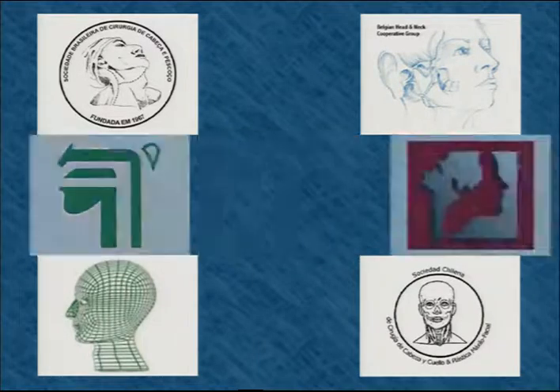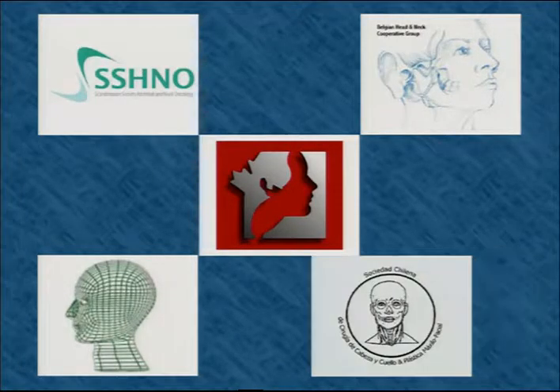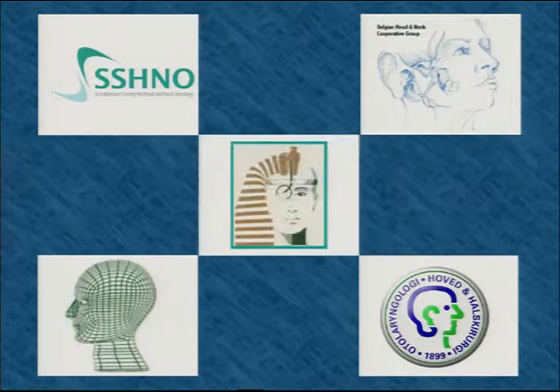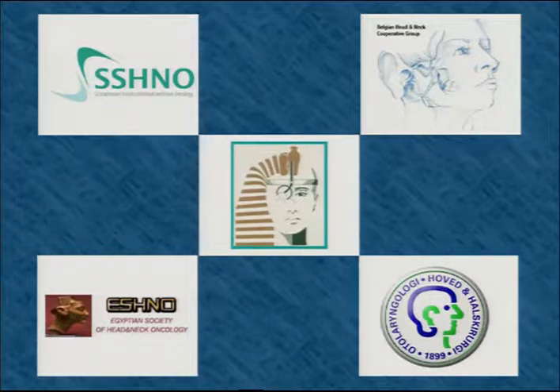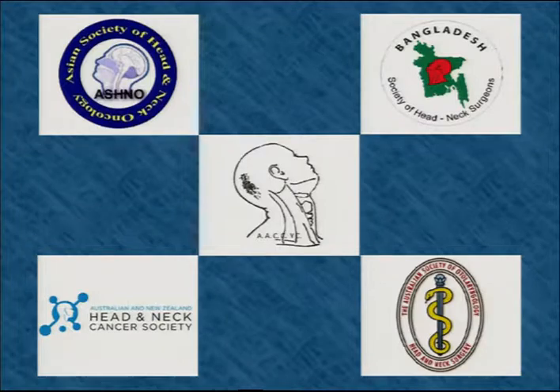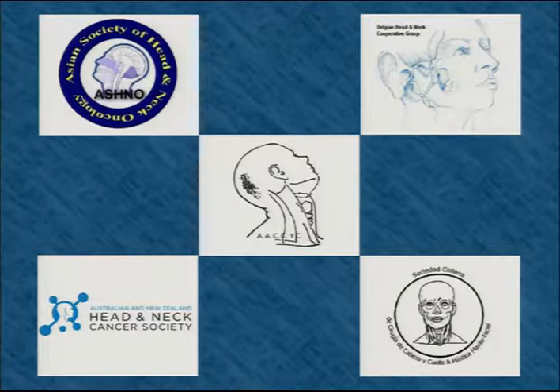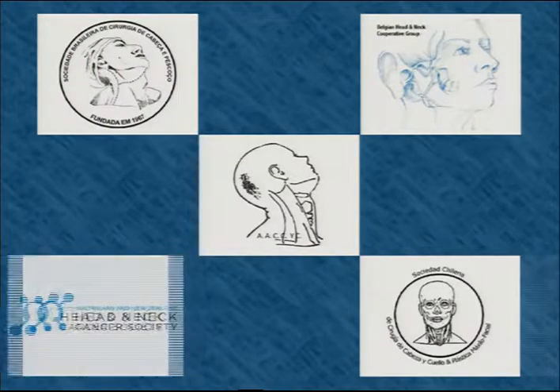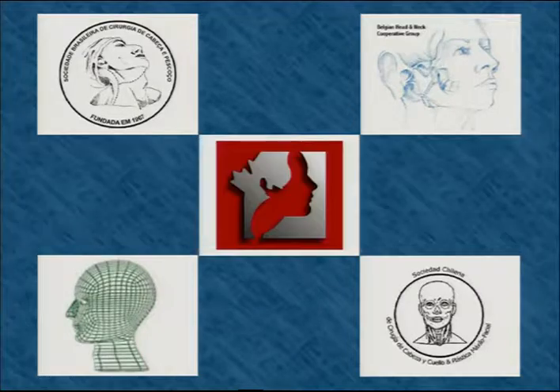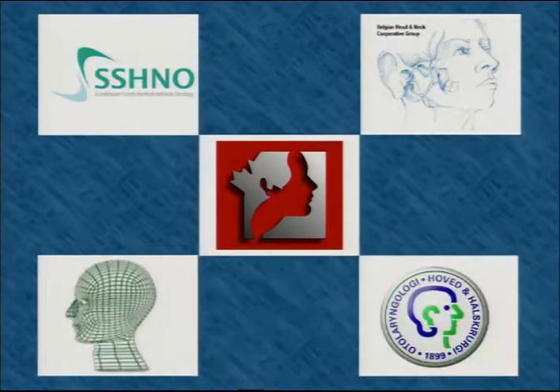And we're looking at the tissues. You saw what we saw in the jugular vein. We're very attuned to anything like that. And when it comes to those structures, as well as the spinal accessory nerve, if there is no plane between the two, and especially in this situation, we don't hesitate to remove the spinal accessory nerve or the internal jugular vein. In fact, when we looked at our experience with those sort of salvage neck dissections, in about 25% of the cases, we end up resecting a portion of the internal jugular vein. And in about 12% of the cases, we resected a portion of the spinal accessory nerve.